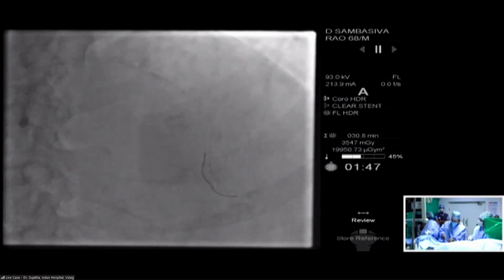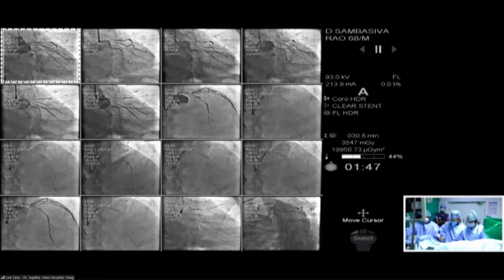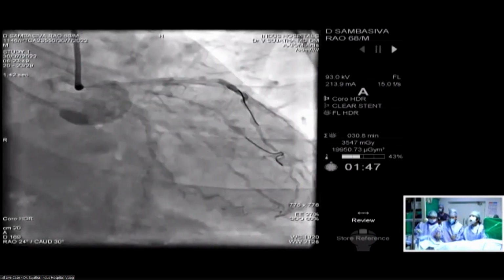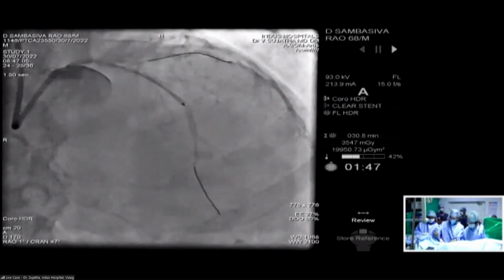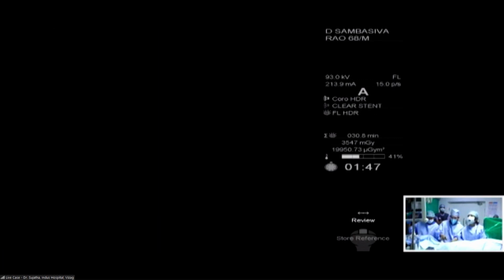Show meanwhile whether the POT and DOT. Sometimes these larger balloons need a 6 French guide, right, madam? Yeah, I took a 7 French, sir, through a slender sheath, transradial, with the radial down. So I might have some problems in pushing things.